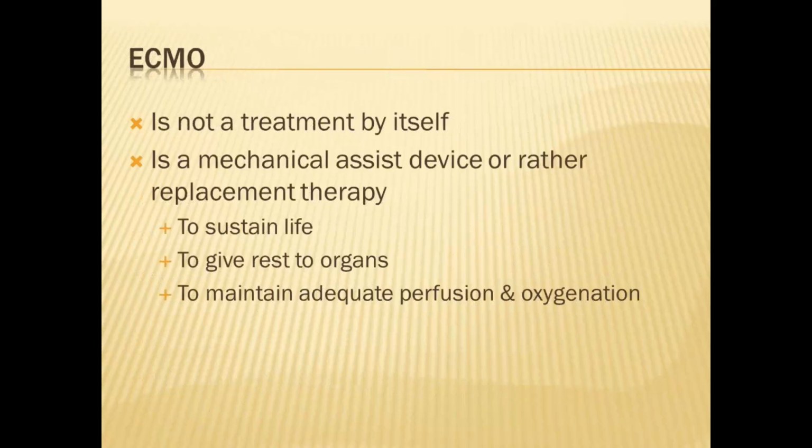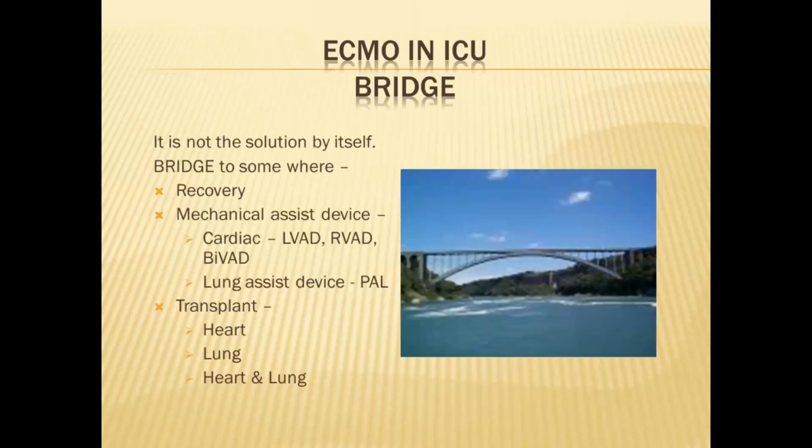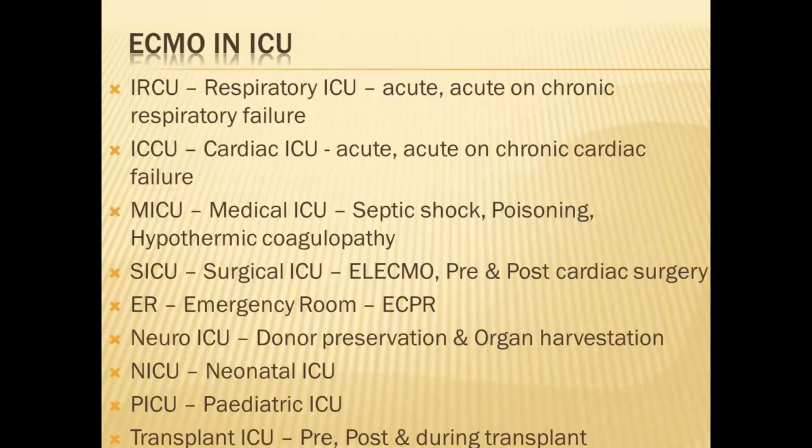ECMO is not a treatment by itself. It is a mechanical assist device. It helps as replacement therapy to sustain life, give rest to the organs, and maintain adequate perfusion and oxygen. So ECMO, as I say, is a bridge. It's a bridge to recovery, or in chronic failure, a bridge to a mechanical assist device, cardiac or lung, or a bridge to transplant. So remember that for ECMO to be initiated, there has to be some end goal.